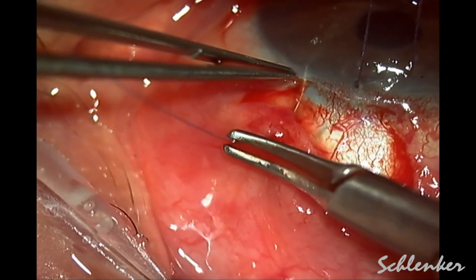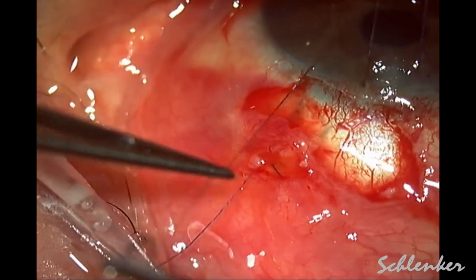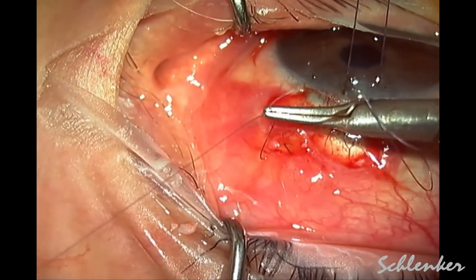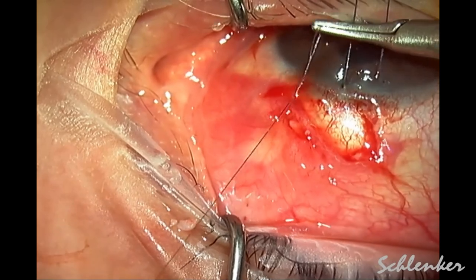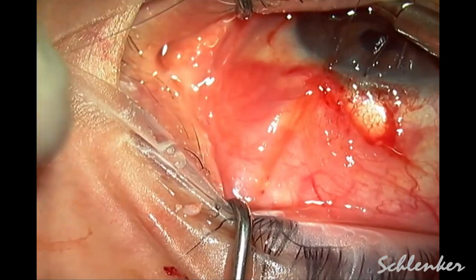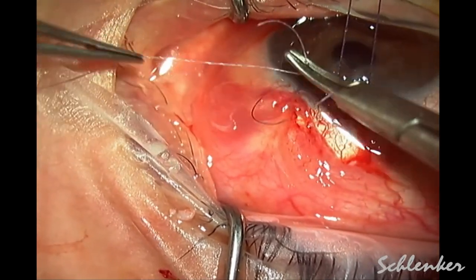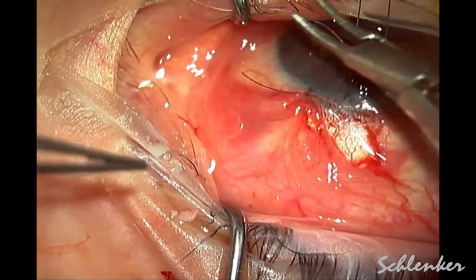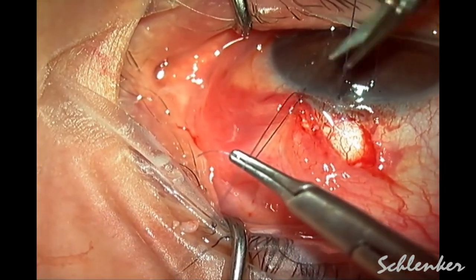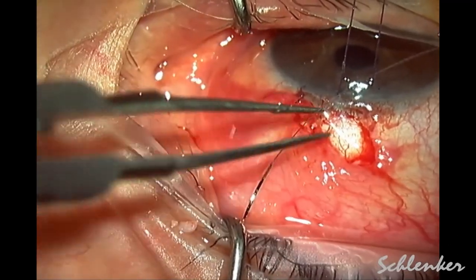At the end of the case I did not have a formal side port, so I used a 30-gauge needle on a BSS cannula to inject into the anterior chamber and then assessed for bleb formation at any Seidel-positive areas, paying particular attention to the limbal area.